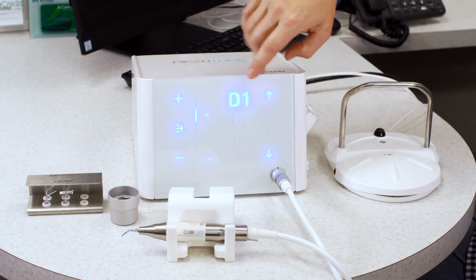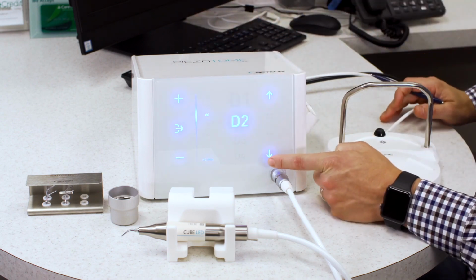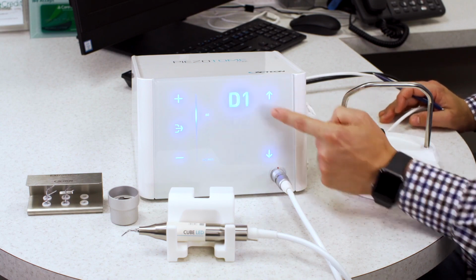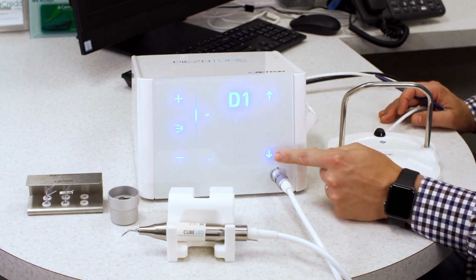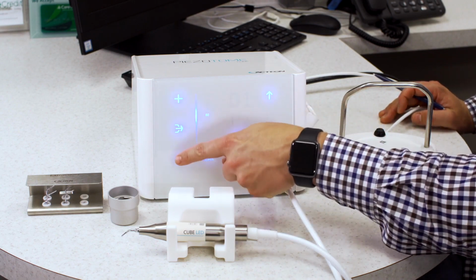What I like about this Cube is it has the main device here, it has a water control here, and then it's very simple. It has really just a couple of buttons. One is the D1, D2, D3, or D4 settings, which is basically your power output. Obviously your highest power is for D1 bone, and then you can decrease power for softer bone. And then over here you have your water output.